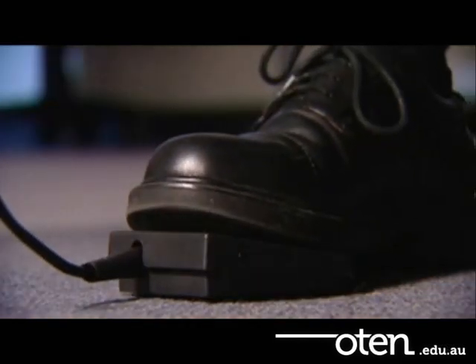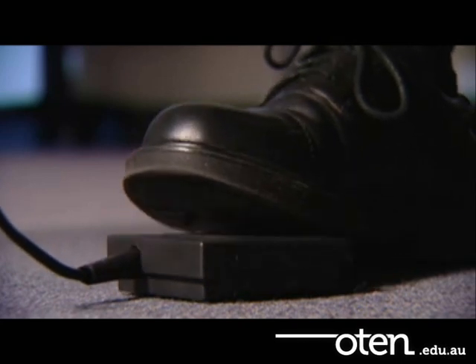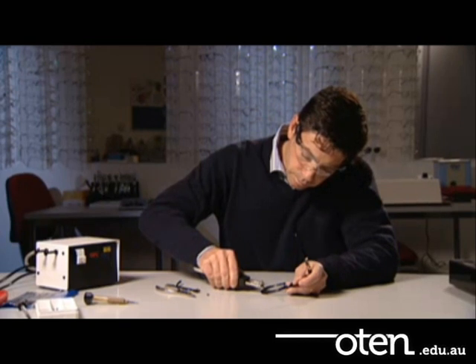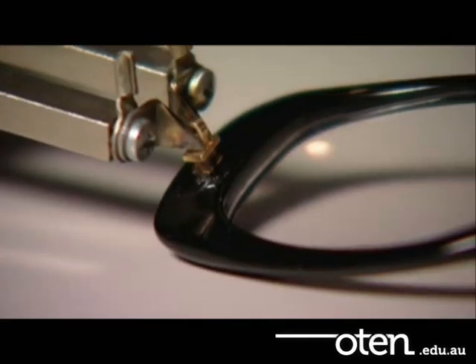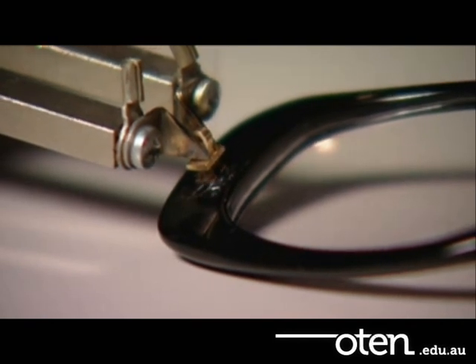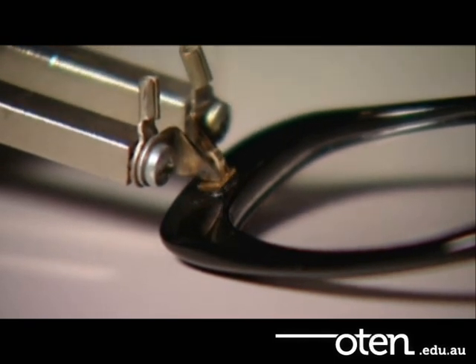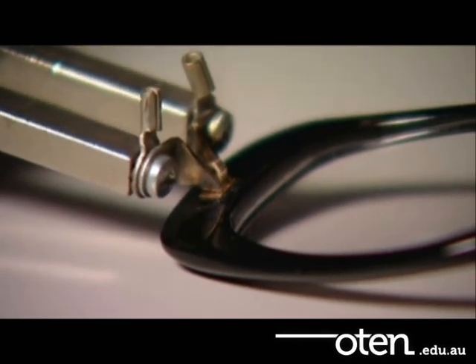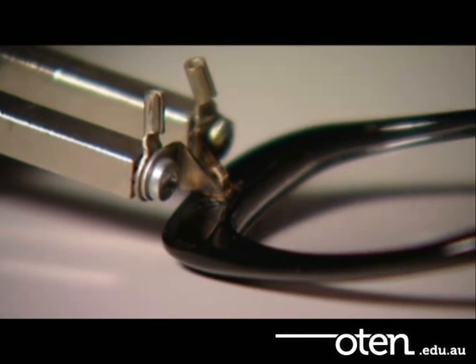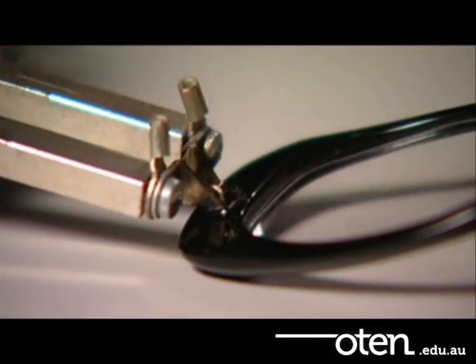Press the foot pedal to allow the current to flow. While the hinge is heating, position it into the frame. The heated hinge will sink into the frame. Make sure that you place the hinge at the correct depth and that it's level. Do not overheat the hinge, as it will burn and distort the frame bed.